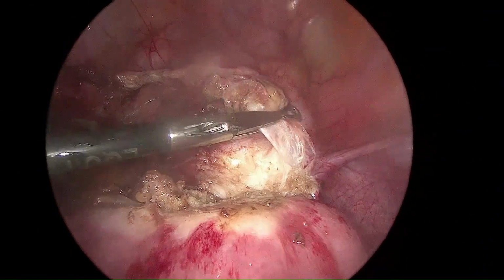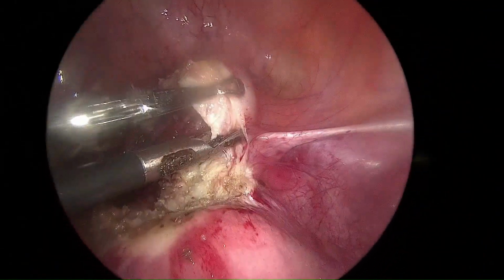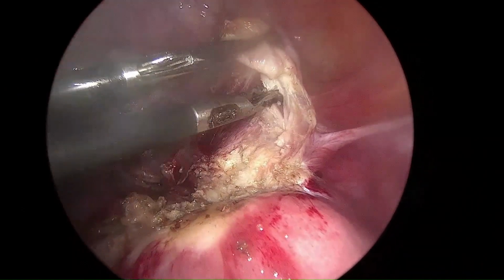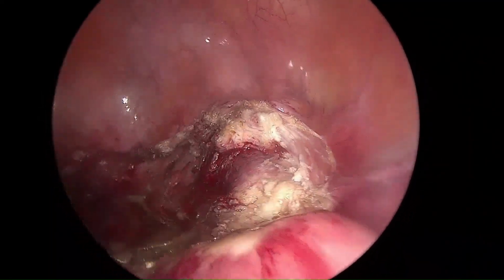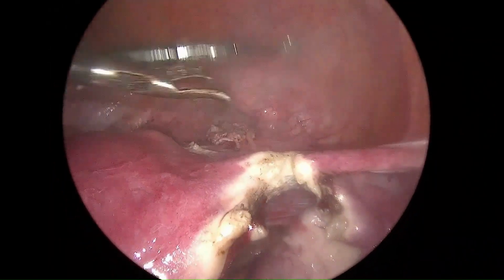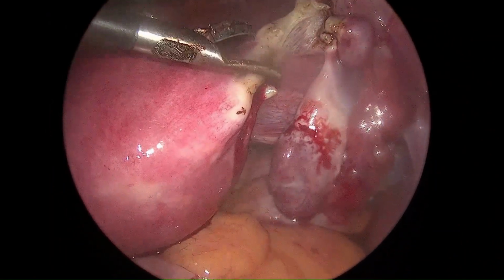This way, giving traction on the entire bulk of bladder fibers, creating a window underneath, delineating or demarcating the scar area, and separating the scar from the cervix underneath is repeated several times so that the entire bladder is separated from the cervix.